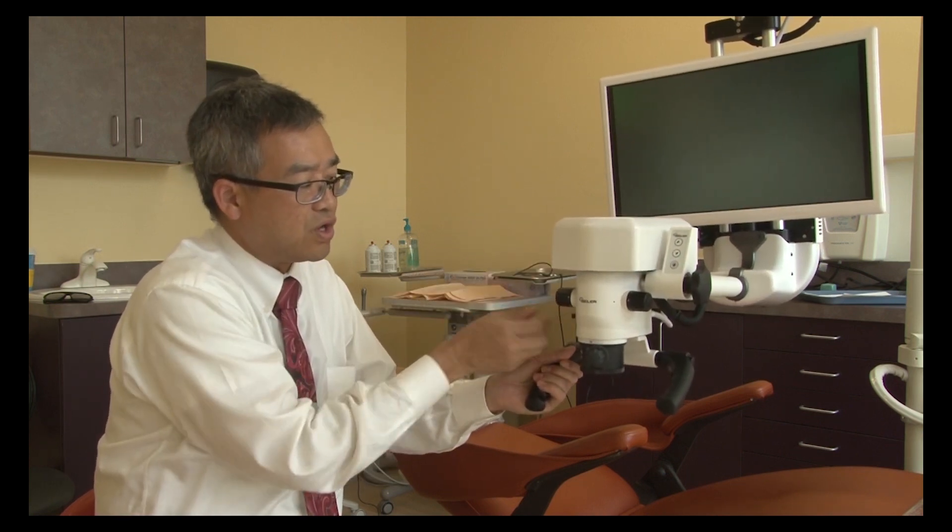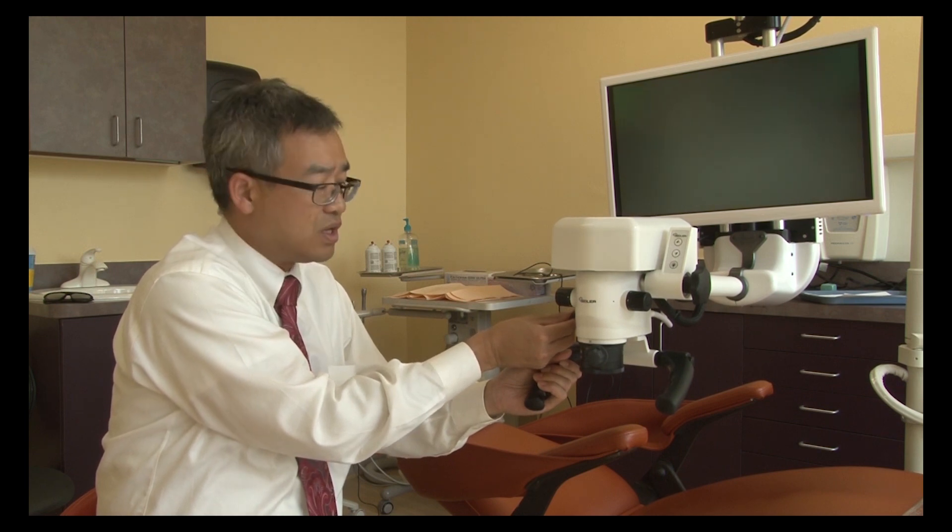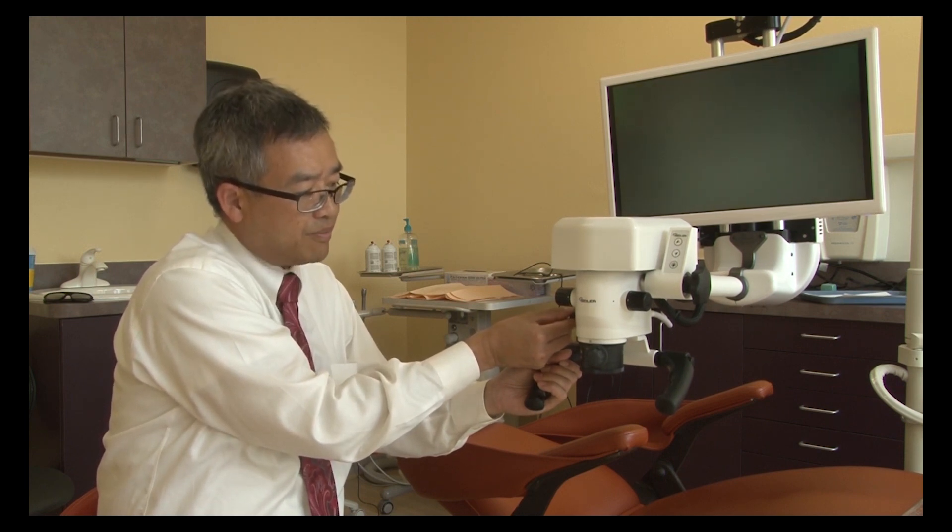Let's move on to the filter. This offers you the filter for composite but also a green filter that allows you to distinguish blood from tissue.